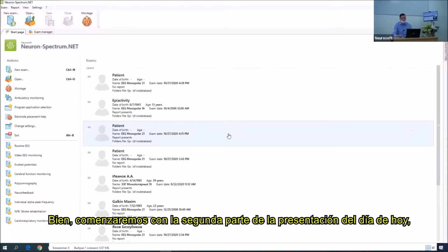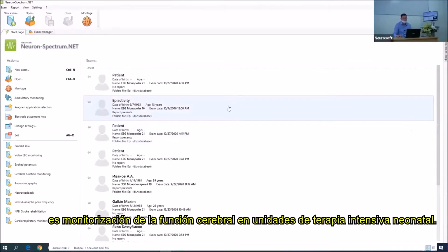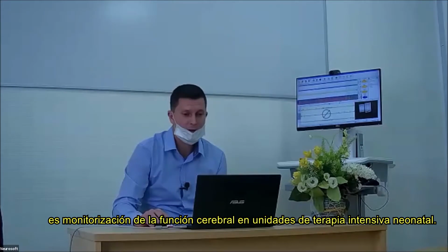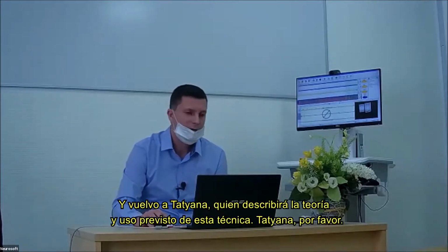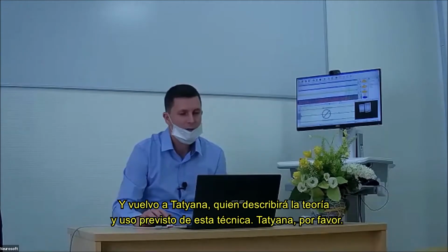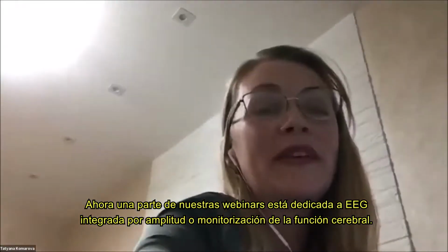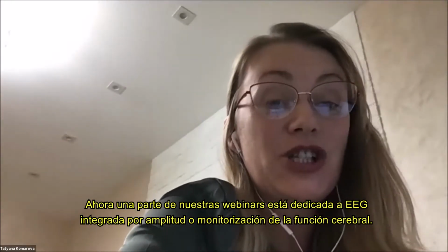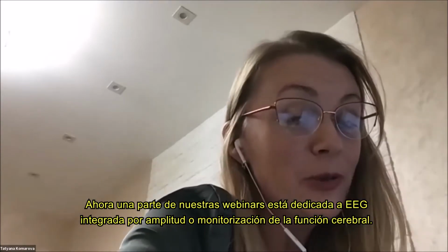Okay, now let's start the second part of our presentation today. It is cerebral function monitoring in neonatal intensive care units. And I hand back to Tatyana, who will describe the theory of this technique, or the intended use of this technique. Please, Tatyana. So this part of our webinar is dedicated to amplitude integrated EEG, or cerebral function monitoring.